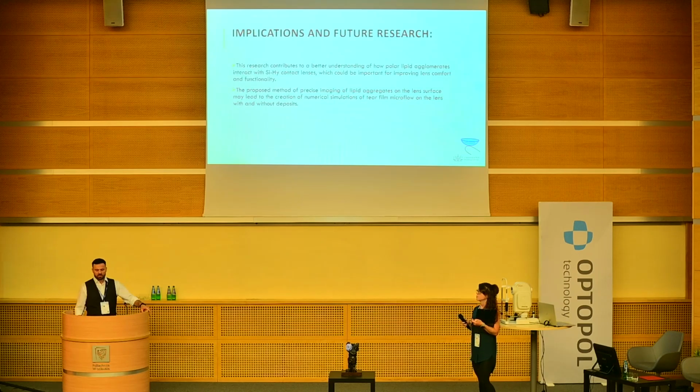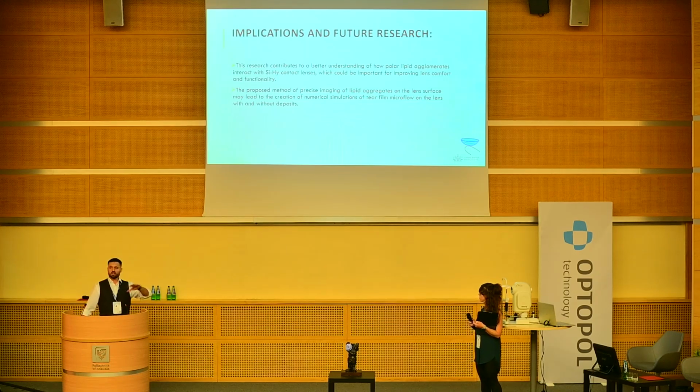So some applications for future studies: for example, this method allows us to make very precise scan maps of the lenses with the deposit on them. So maybe it will be possible to use it to make some numerical simulation of the tear film flow onto the lens with and without deposits. So that's all from my side.